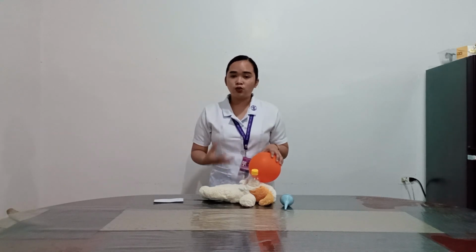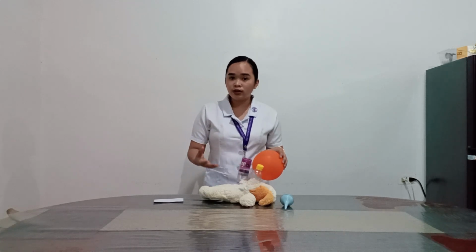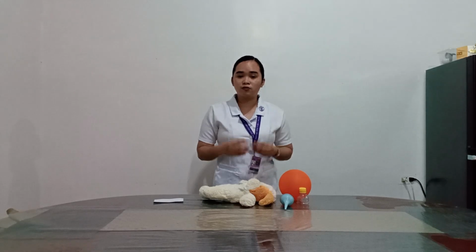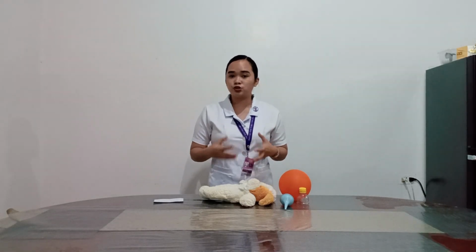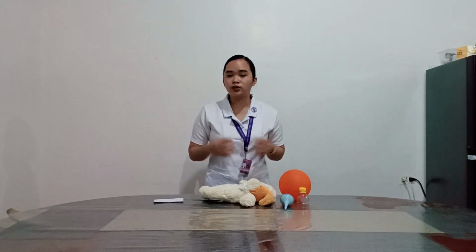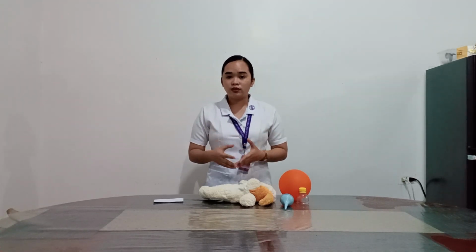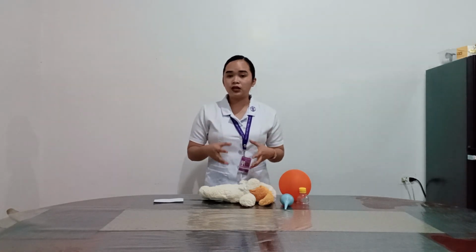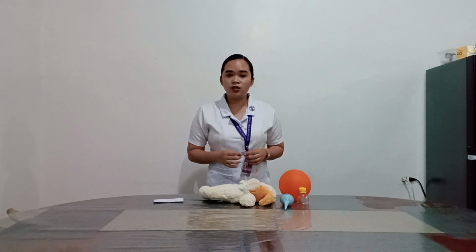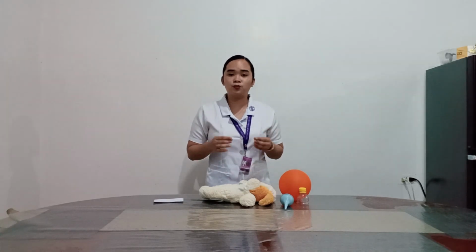So after doing that, we have someone attach the cardiac monitor and pulse oximeter to the newborn to keep track of the baby's heart rhythm, and the pulse oximeter, which measures the hemoglobin oxygen saturation, will help us monitor the efficacy of the CPR. So if there is no increase of heart rate, or if it is still less than 60 after 30 seconds of performing the PPV, we will have to proceed and perform chest compressions and rescue breaths.